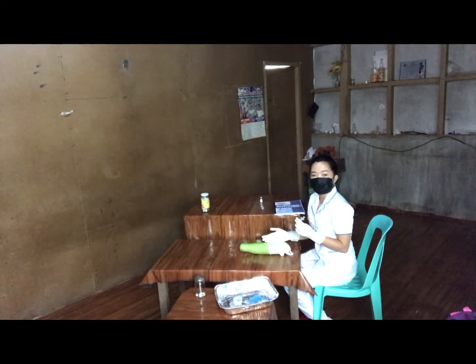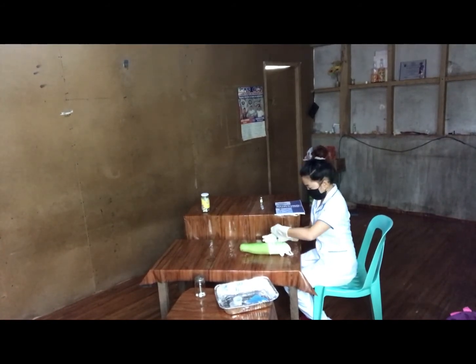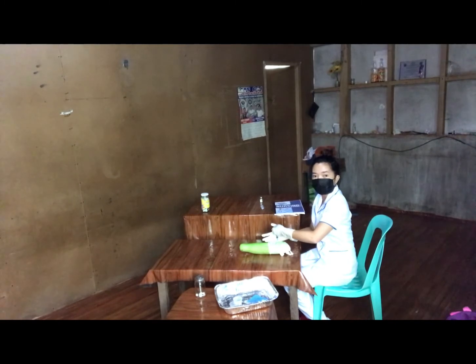Then take our dominant hand with the injection needle and we're going to do it like this. Like shooting a dart at a 90 degree angle, you do this quickly to reduce pain, so we keep it steady. Depress the plunger and instill the fluid slowly over 10 seconds. Once instilled, let the fluid go down to the muscle. And next, withdraw at the same angle we used to insert it.